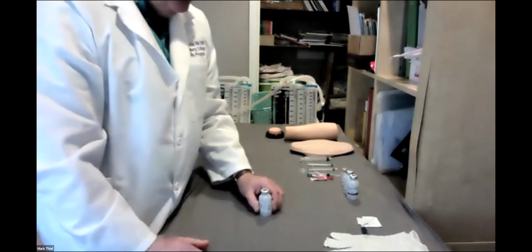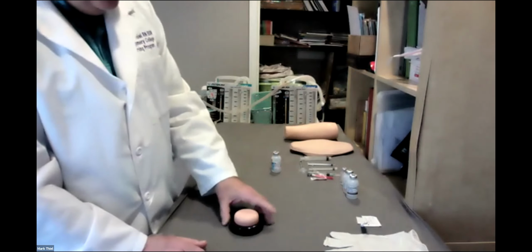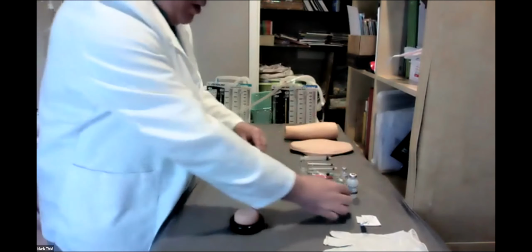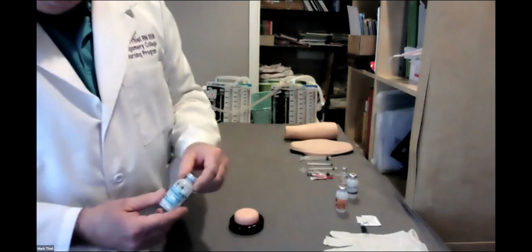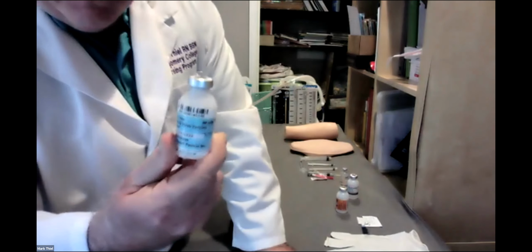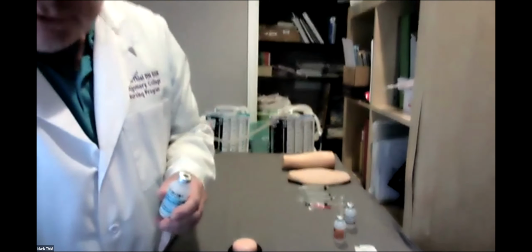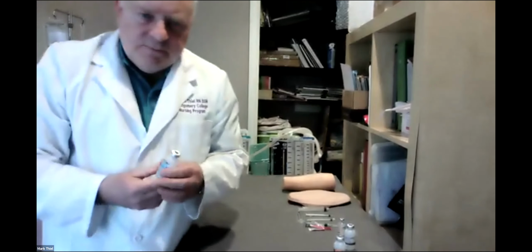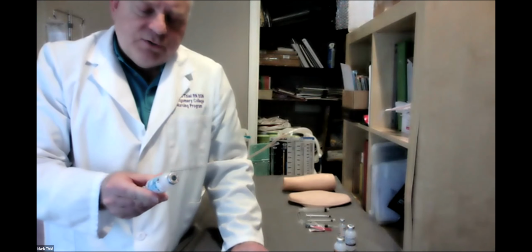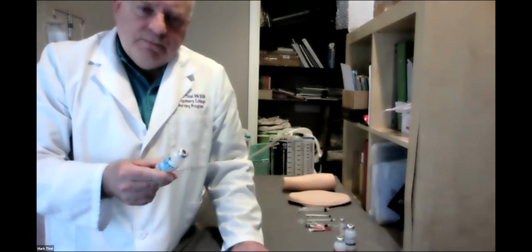First, let's go to the intramuscular. Today, what we're going to be giving first as our demonstration medication is influenza. That's the way it will read on the physician's note: influenza vaccine dosed as 0.5 milliliters.